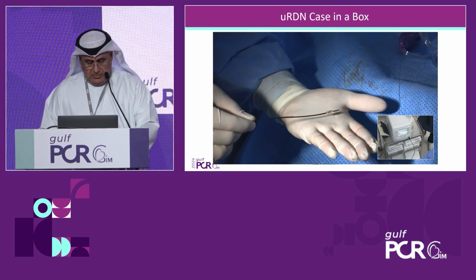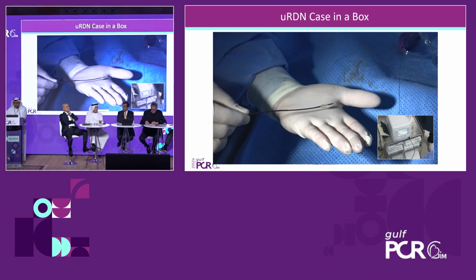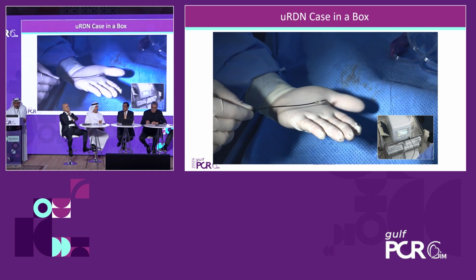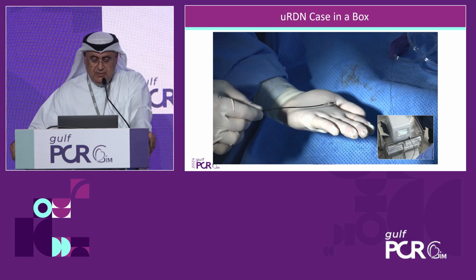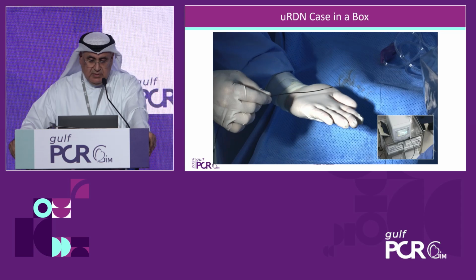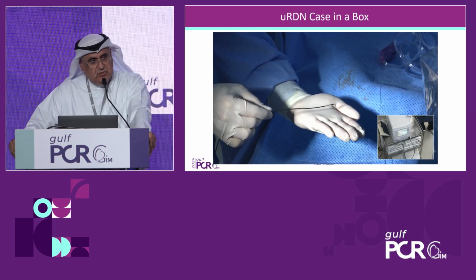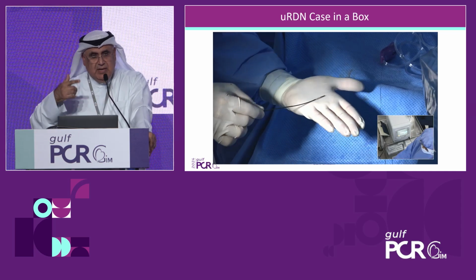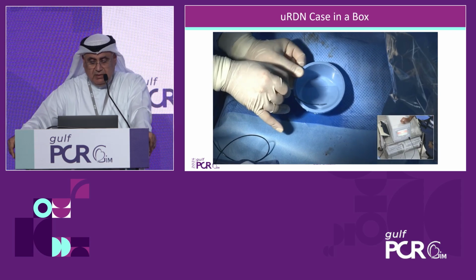So you will go to the video. It's a short video. How the balloon is filled, and this is how we fill that with this cooling or hydrocooling solution, just to demonstrate. So it's a 5 millimeter emitter there, or transducer as mentioned. The damage to the vessel wall directly. This cooling effect will avoid the direct heat or thermal damage to the renal artery.